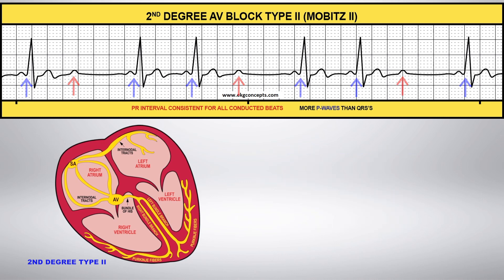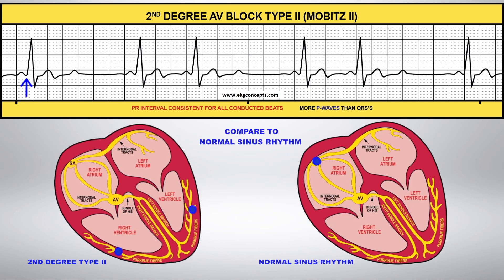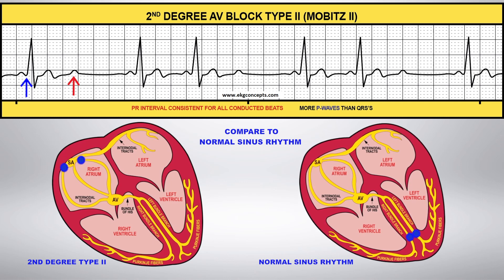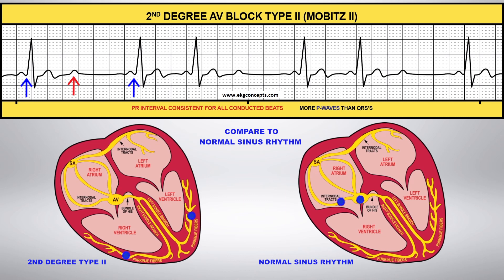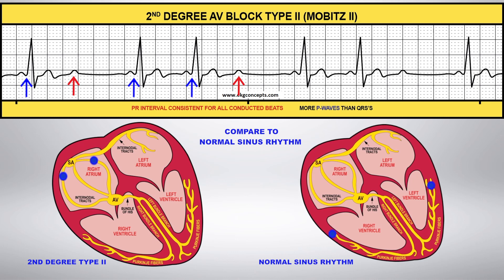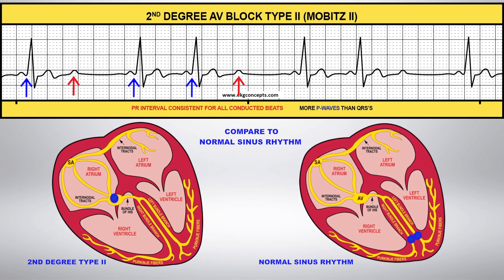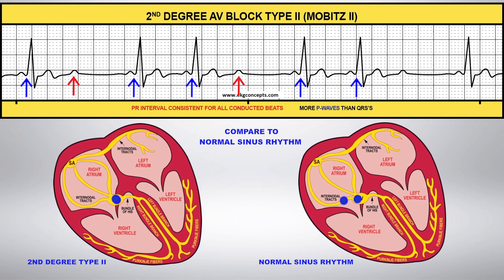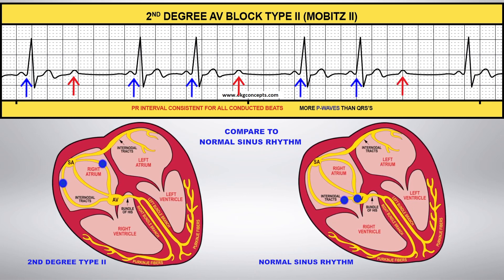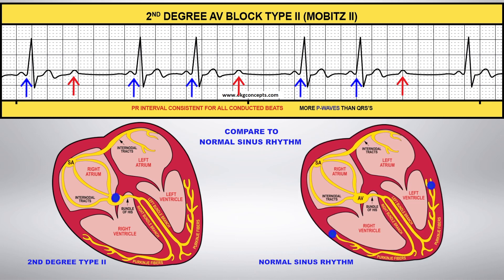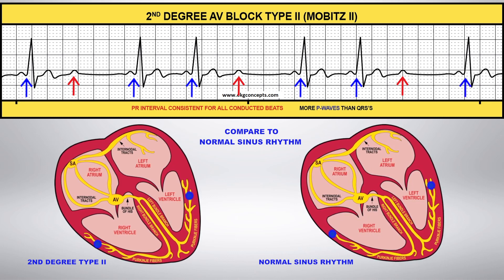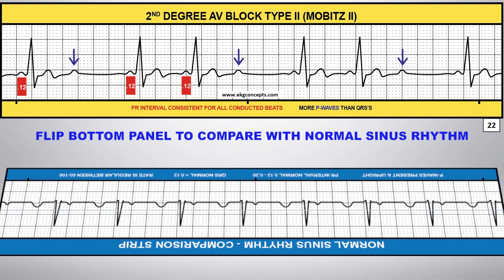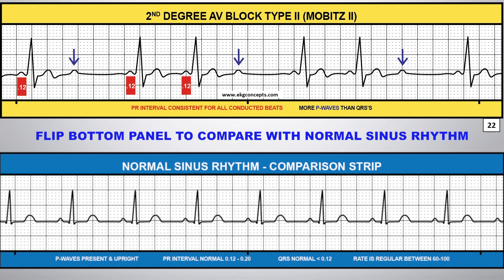Compare this to normal sinus rhythm. You can flip the comparison strip on the bottom panel to compare this rhythm to normal sinus rhythm.